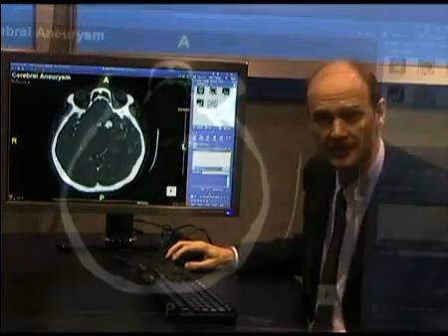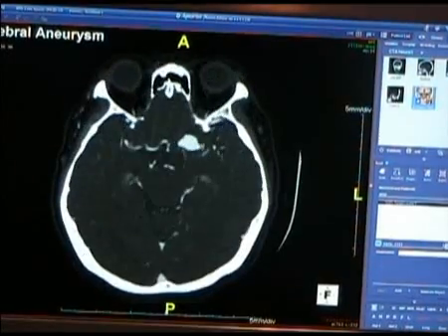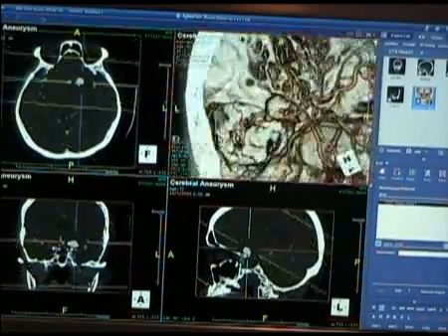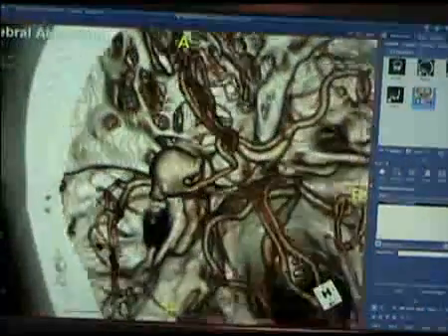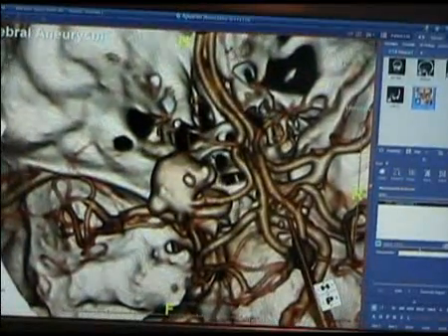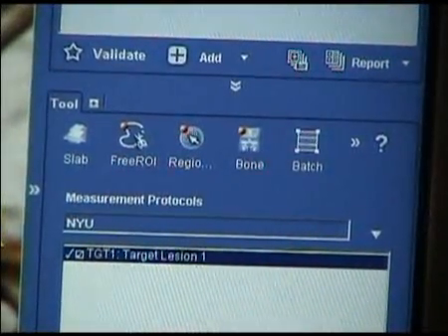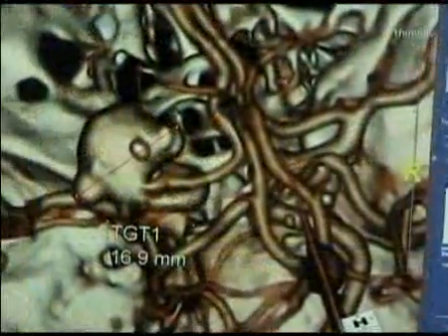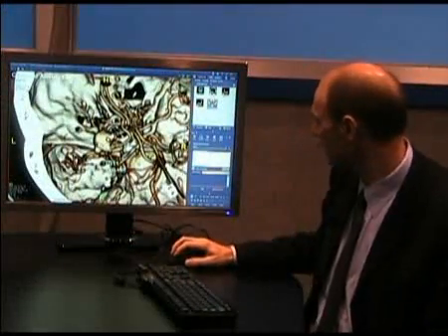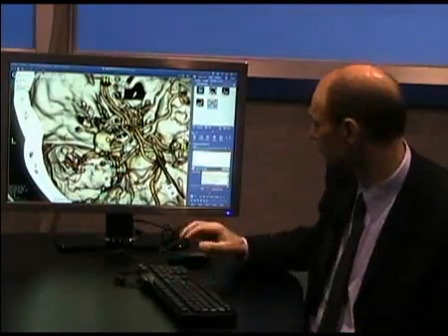When interpreting this, you can detect the aneurysm quite easily, but now you may want to quantify that. The challenge is always how do you take this measurement and get that into the reporting system without having to dictate it again or transcribe it, which may cause errors. The way our system works is we deliver this advanced visualization directly into the workflow, because the software will be run on the PACS, and we provide standardized measurement protocols where you can define the measurements you would like to make, perform those measurements, have the labels automatically assigned, and then apply observations which are supported by Radlex lookup of the terminology.